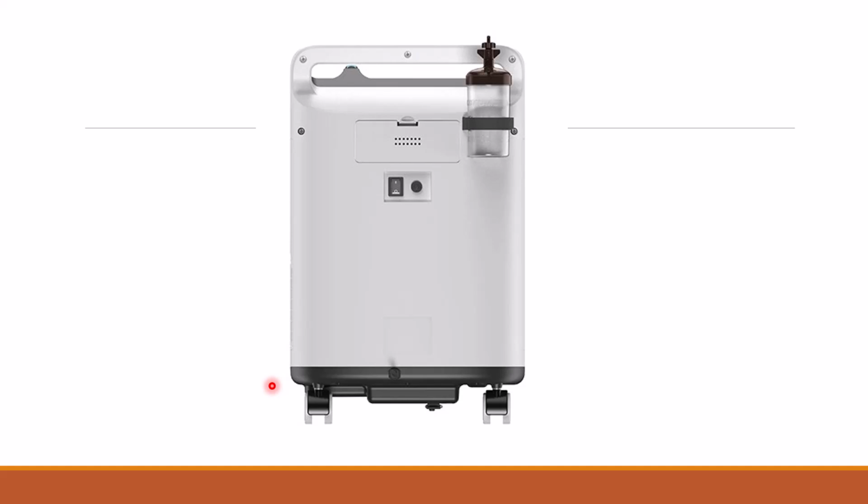And the most important thing when you're dealing with the oxygen concentrator is here we have the inlet of the air from the atmosphere. Don't stick it to the wall or put something on this area, because it's very important to have empty space around the device.